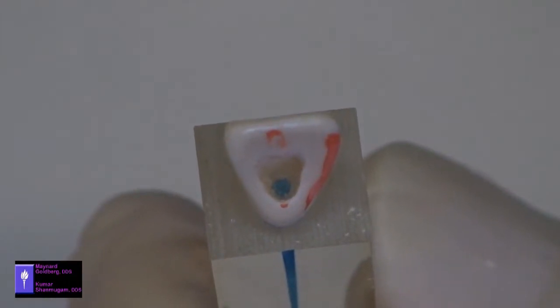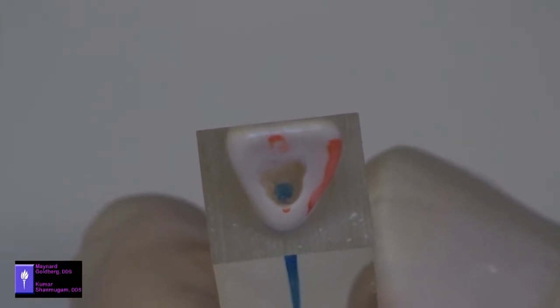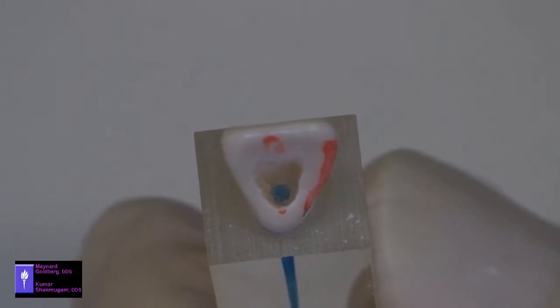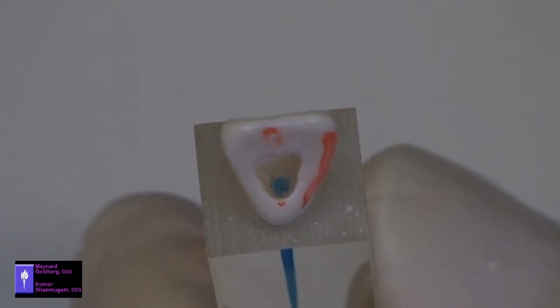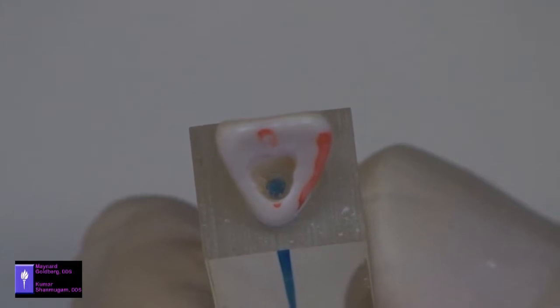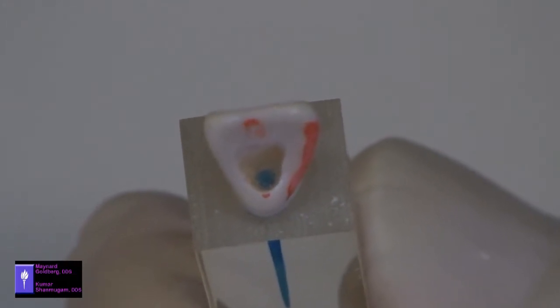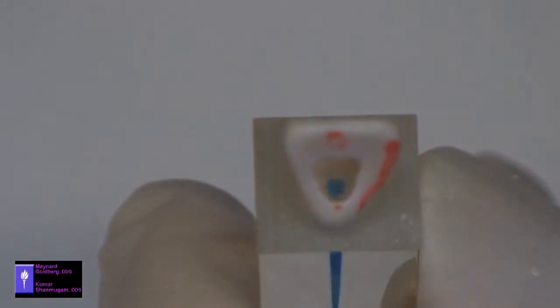And this is a properly well-designed access cavity. You have full vision of the orifice to the canal. The instruments, when placed into the canal, can move around freely without contacting the coronal tooth structure. And the ratio of enamel to dentin has been maintained.